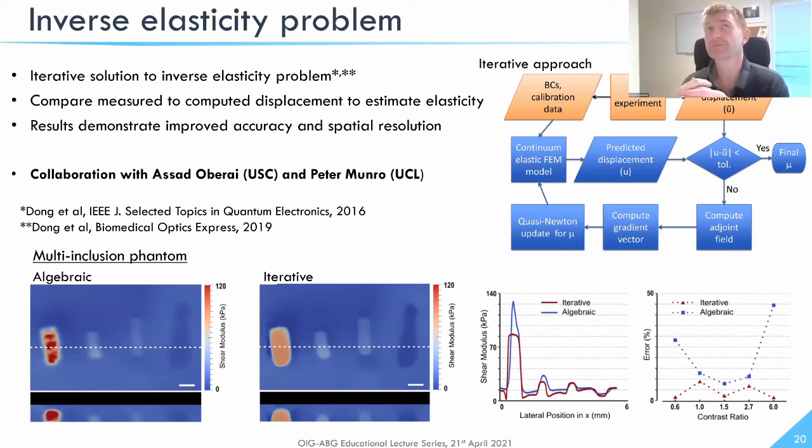I think the biggest impact we've seen of blood is actually just blood dispersed on the surface of the tissue from an optical point of view, attenuating and mucking up the beam. So we irrigate the cavity with saline to try and reduce that effect, but that's definitely, as with all optical techniques, can be problematic. But in terms of how it disrupts our mechanical deformation, we haven't seen too much evidence of it.